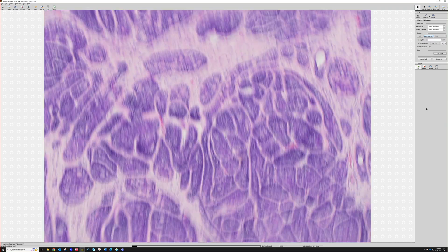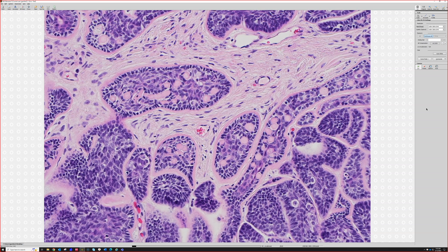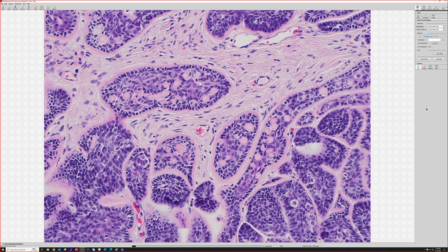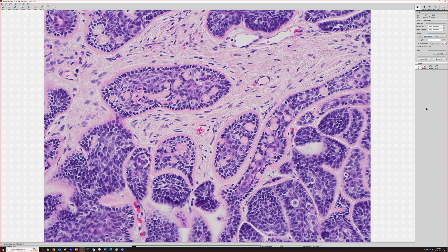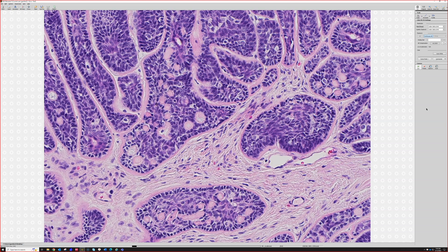They often have a dense layer of basement membrane — collagen type four — surrounding the outside of the nests, like a thick pink layer. That layer is often squished between the nodules, and then they tend to have these little droplets of basement membrane, these little round sphericals of basement membrane, in the midst of the nests too.